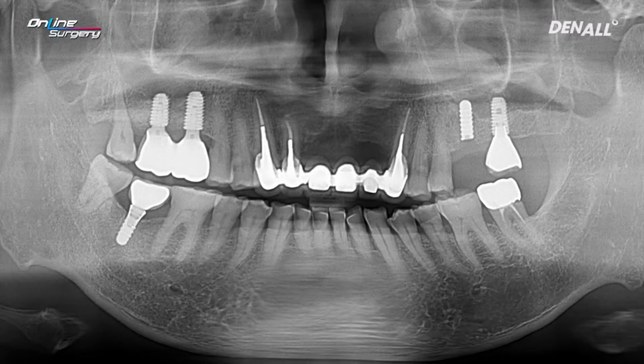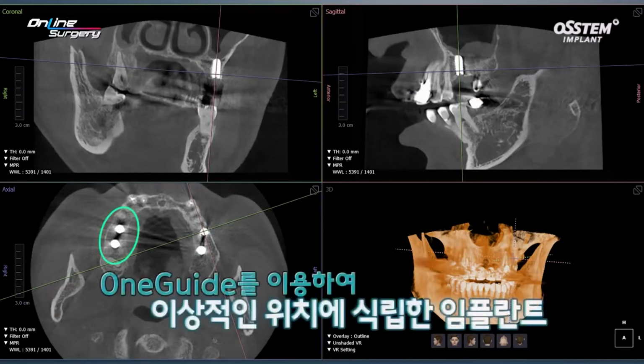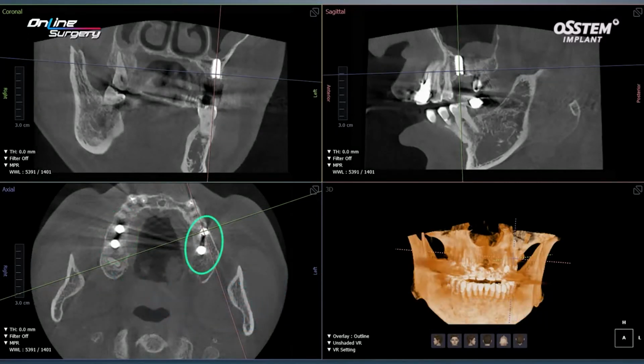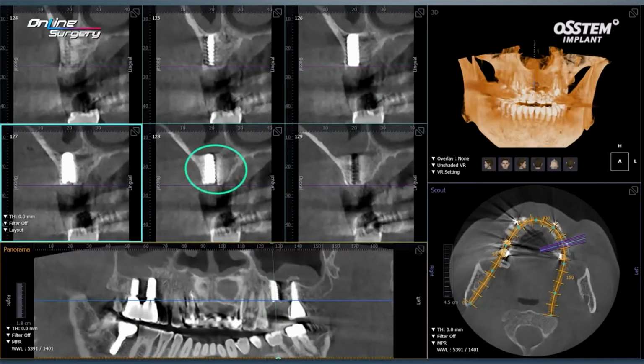I checked the CT once again. Compared to the implant that I placed using one guide, which is nicely placed within the alveolar bone, not only is it thin, but it is buccally inclined. And on CT, although it is buccally inclined, the buccal plate did not melt away yet. I plan to remove the implant and place the implant again.